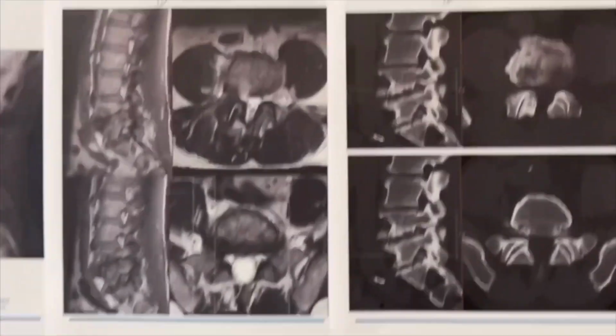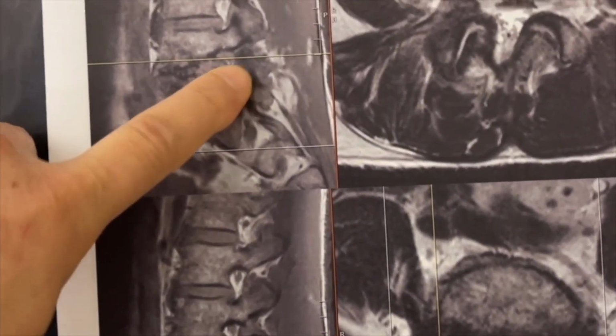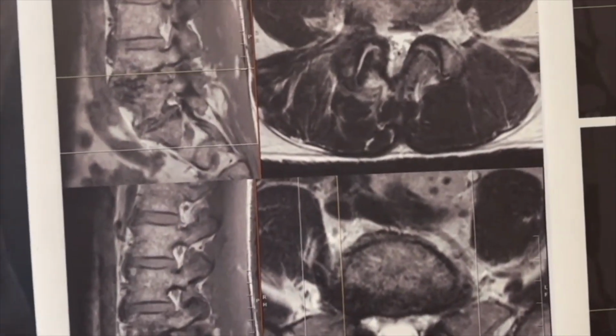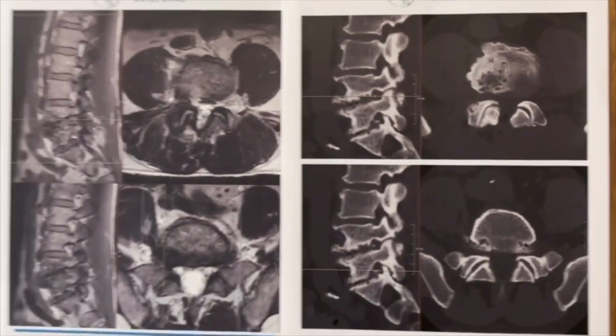These are challenging cases because the nerve root is right there, tucked in between all the bone spurs and the pedicle and the facet joint. And we need to keep them intact. I have a bunch of little tricks, including the use of the Wolverine. And we want to make sure that the nerve is intact too, because that's what we're treating.